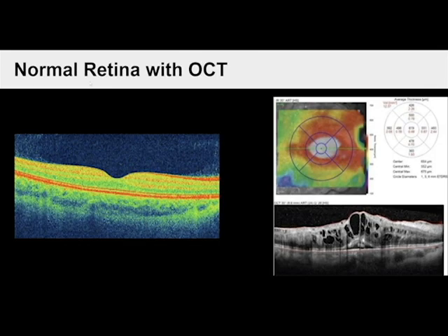So now we're going to talk a little bit about how to interpret an OCT scan. An OCT scan looks almost like a color map with warmer colors showing thicker retinal areas and cooler colors showing thinner areas. White is the thickest with high reflectivity and black is the thinnest. All machines have a thickness map displaying average retinal thickness values.